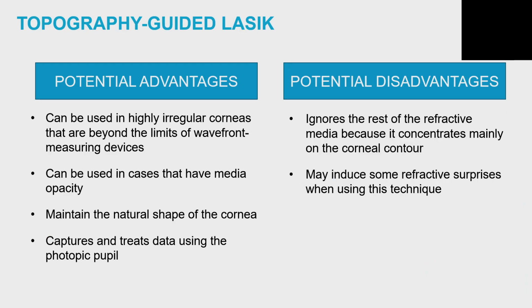When you look at the advantage of topography-guided treatment, obviously you can treat irregular corneas, you can try to improve the corneal shape, and it can capture and treat the patients on their photopic pupil. But the disadvantage is it ignores the complete refractive situation as far as the eye is concerned, and when you are correcting something extra on the surface, that could change the refractive endpoint.